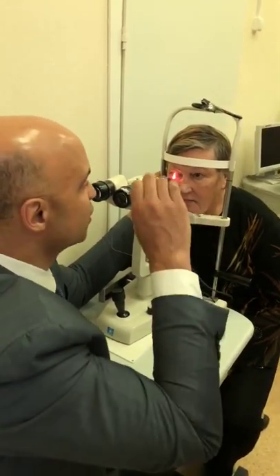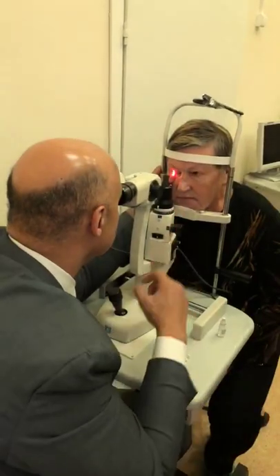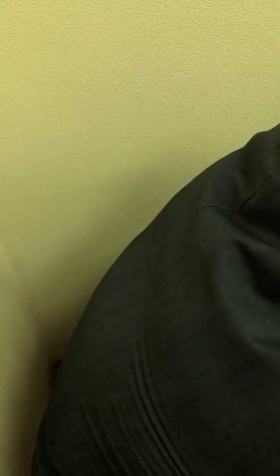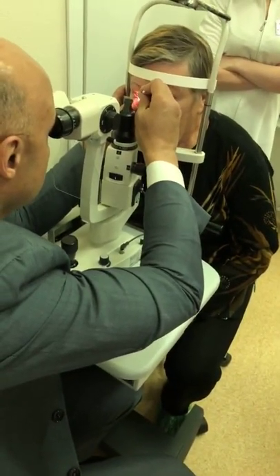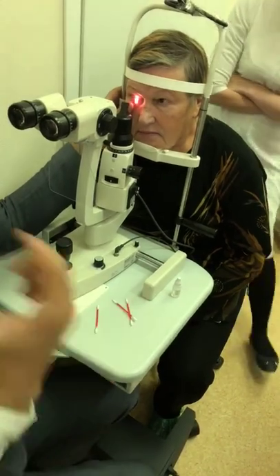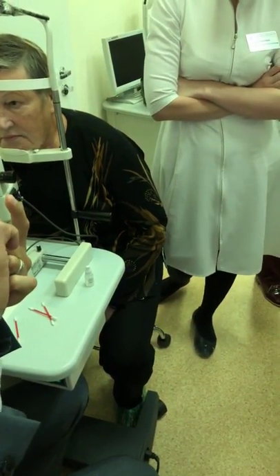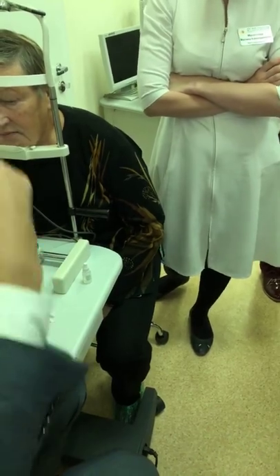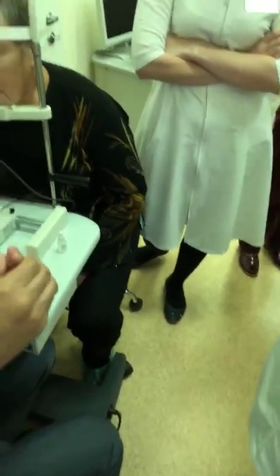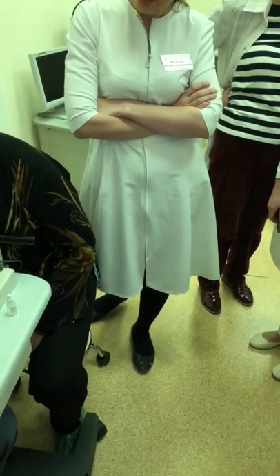Tell her to blink. Tilt your head forward. Good. And look up. So she's got a lot of junk in her glands. When you do expression, the gland is like a test tube. All that stuff is accumulating in the bottom of the test tube. So you want to squeeze from the bottom and get all that stuff out. You don't want to squeeze in the middle. If you squeeze in the middle, you'll pinch off the lower part of the meibomian gland, and you won't get all the stuff out.